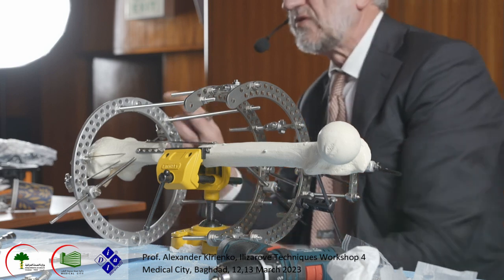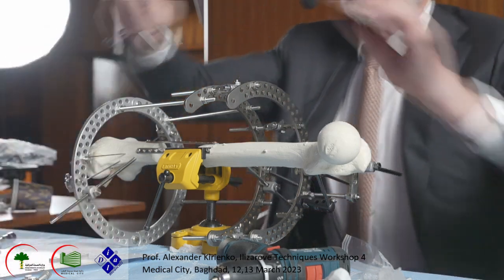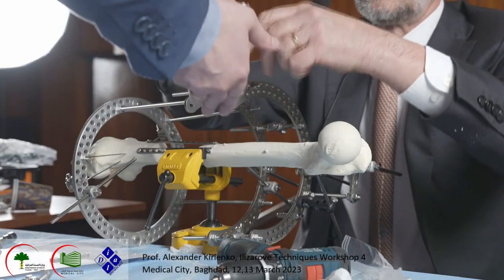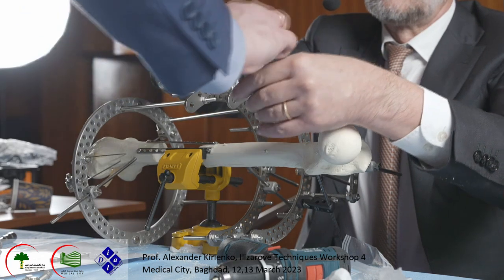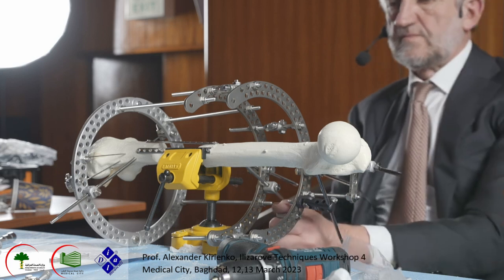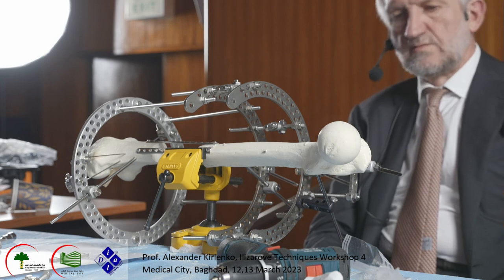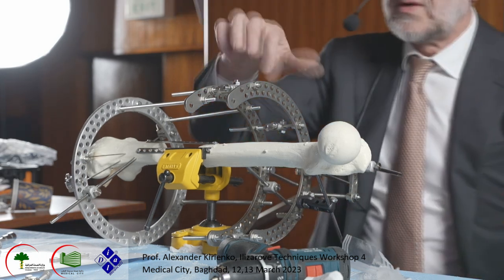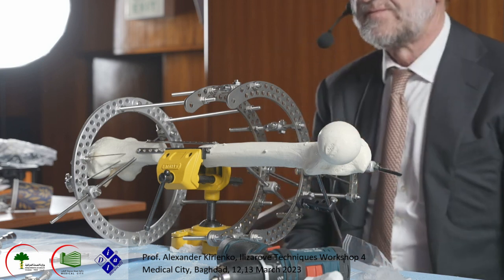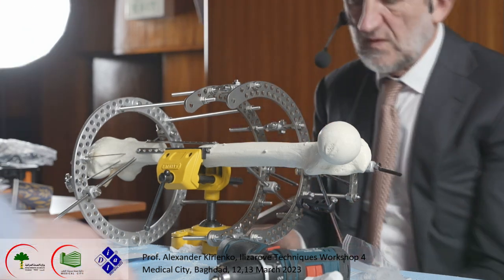You need another rod with female, like this. Maybe you put two more holes. One hole with female nut. Okay, fix it, please. Okay. Because this is an important system, because we need to control the varus during lengthening on the proximal part. Okay. Nut.